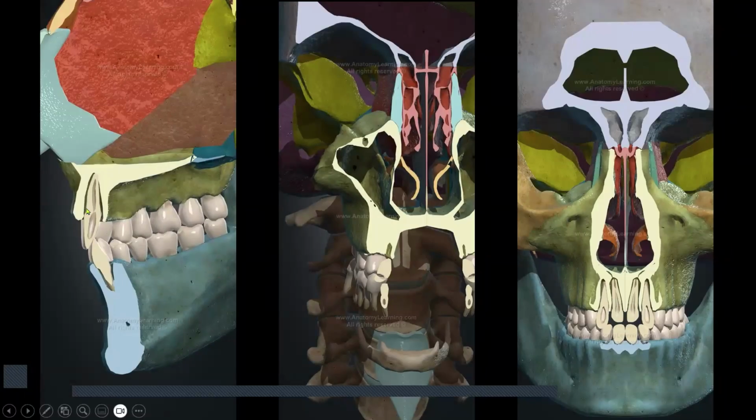Now, again, you can see in another picture. This is your incisor. So this incisor is near to the nasal floor. If we want to extract the tooth and place an implant, you just have to remove it, and only this much drilling you have to do to enter into the nasal floor. And once you enter into the nasal floor, that means the osteotomy is over. That's a single drill system that we require over here. And this nasal floor, again, you can see it tapers from anteriorly to posteriorly. That is why more implants are placed anteriorly.